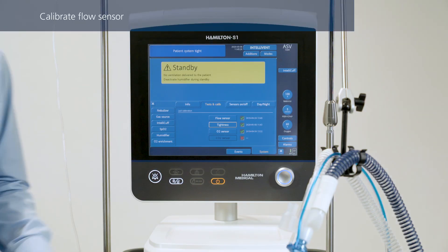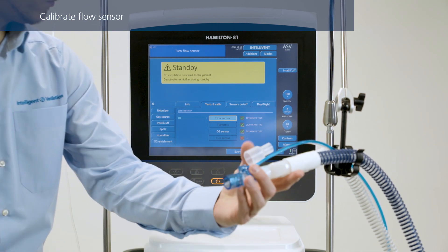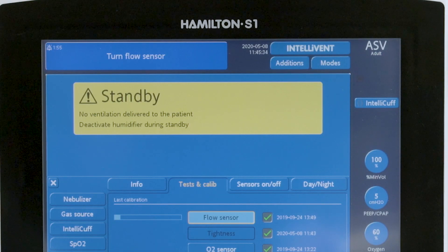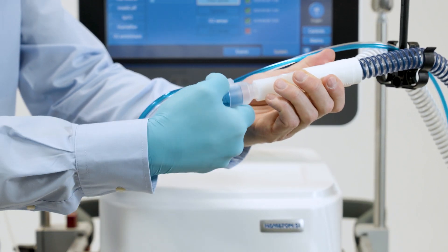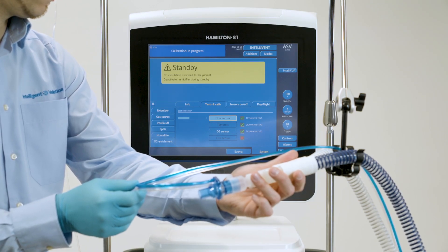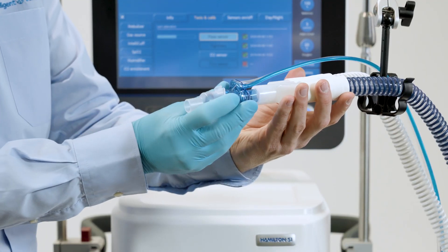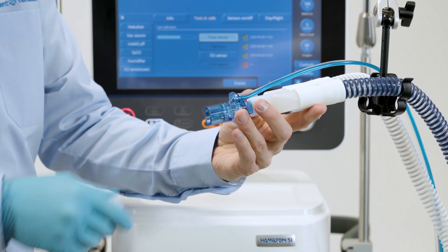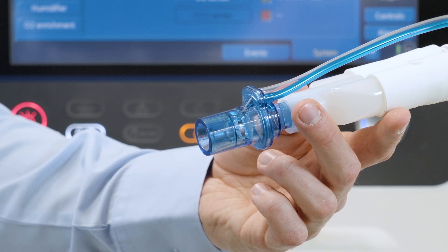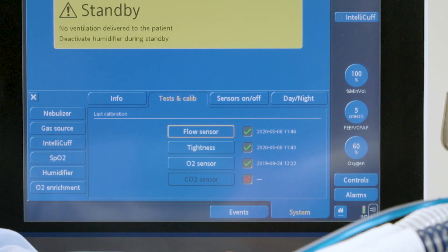To calibrate the flow sensor, select the desired operation, then follow the instructions from the ventilator. Disconnect the test lung and attach the calibration adapter to the flow sensor. When the message 'Turn the flow sensor' appears, flip the flow sensor. Wait, and then flip the flow sensor back to its starting position. Finally, disconnect the adapter from the flow sensor. When calibration has been completed successfully, make sure there is a green check mark in the flow sensor check box.